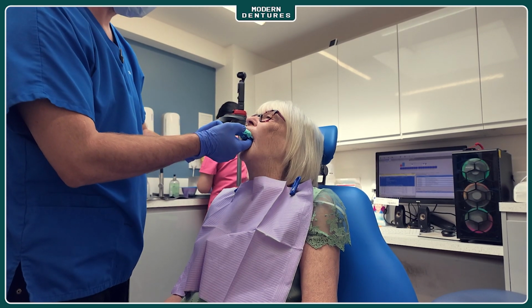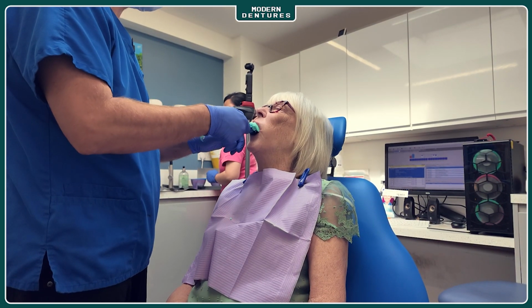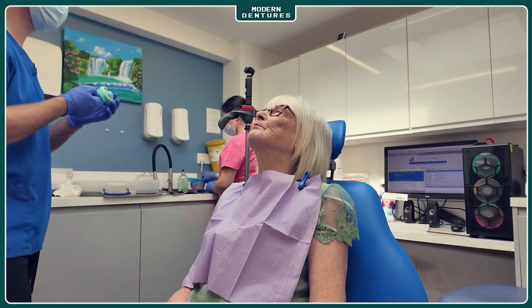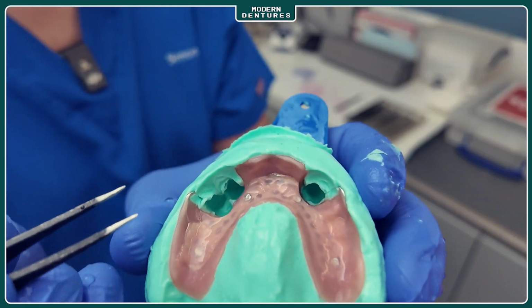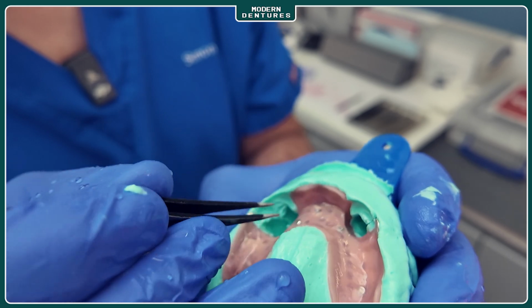Just keep your lips nice and relaxed for me. Now when we take this out, the denture may come out with it or it may not. In this case it has, which is really good. Because it's a chrome denture, ideally we want it to come out with the impression, because there's less chance of the clasps causing distortion. So with this impression, as you can see, the clasps are buried in here, completely buried in the alginate.